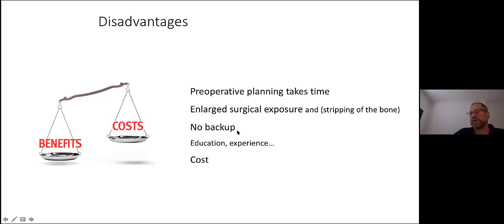That's a problem. For instance, in one of my cases, they didn't order the right plate, even if it says exactly which plate and the number of it. Somebody forgot, and of course it's my responsibility to check that, but I checked it too late. The patient wasn't in the operating room, but we were quite far. And in normal circumstances, I would just have changed to another plate, maybe a little bit larger or smaller or different material or something.